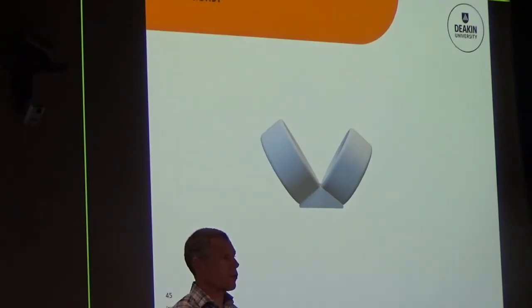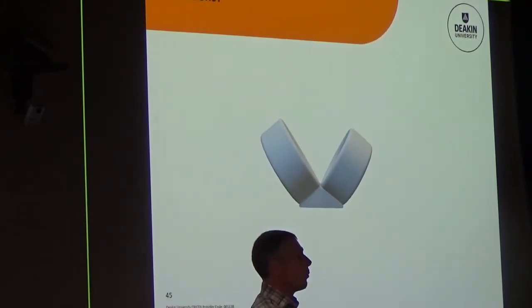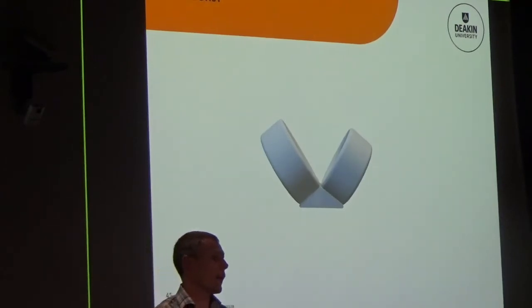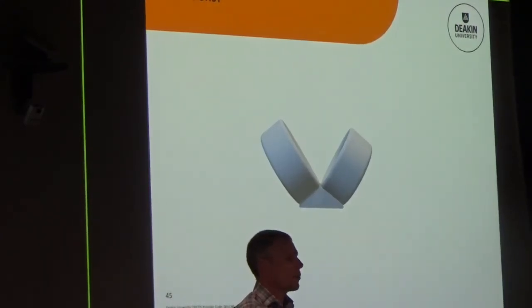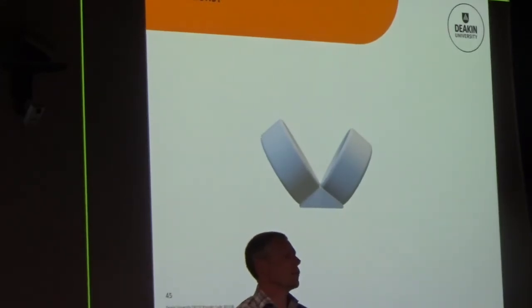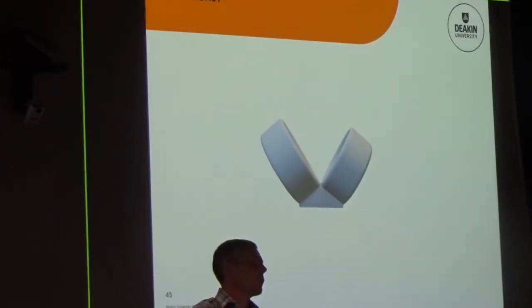Setup wise, I think there would be an initial outlay. The biggest thing is the skill of you guys having to know how to use it. But I think that learning is something, and then how far you take it is where you want to go. Versus, again, people in design and engineering are doing it to a point where they've seen something off the shelf, they're copying it, and then modifying whatever they've copied. So if you wanted to start doing it near immediately, you could. I don't know what the rules are for them as per thermoplastic, how much that's been tested on people's skin. People do get irritations from thermoplastics, but we'd need to delve into that a little bit. But people are already booking on clients.